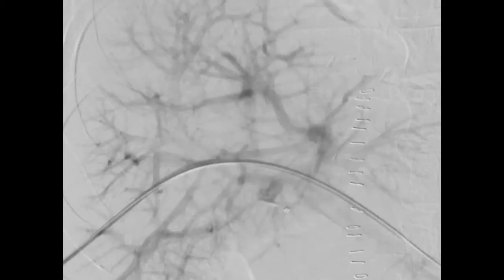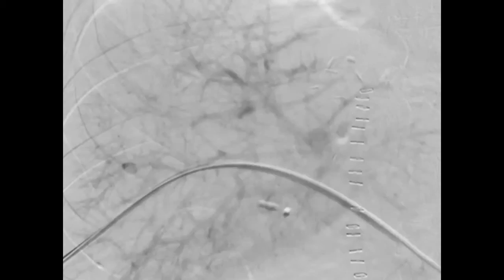It is very important to do a good intervention planning using the CT scan to define which branch you are going to embolize, especially when it deals with segment 4, as the portal vein comes sometimes from the left side and sometimes from the right side.